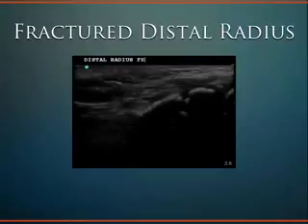surface of the skin, and there typically tends to be a lot of fluid collection and hematomas in association with fractures. And as we know, water and fluid helps the penetration of the sound waves, and so the hematoma actually helps a little with visualization of the actual fracture. So you don't have to push that hard. So you do find that maximal point of tenderness and then visualize there.